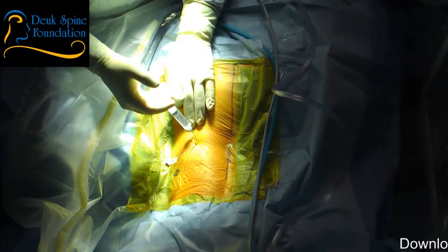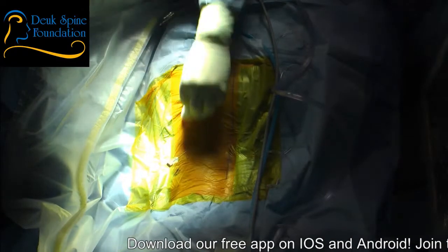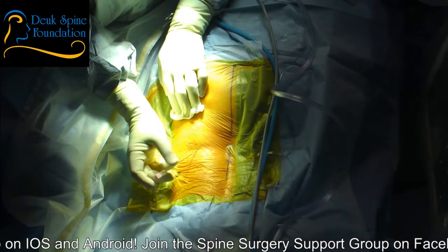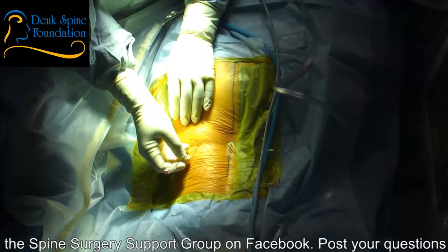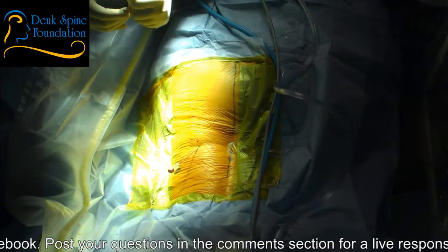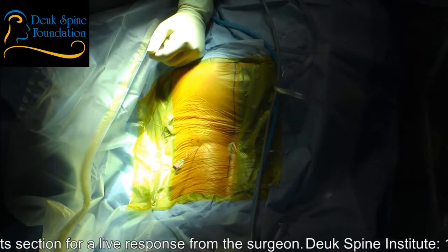How is blood pressure? Perfect. All the other doctors are telling me you can't get the blood pressure down without putting the patient under propofol. But my point is that they think you can't lower blood pressure in the operating room without propofol. How many million people in the United States have high blood pressure controlled with medication and not propofol? So why can't you get there?